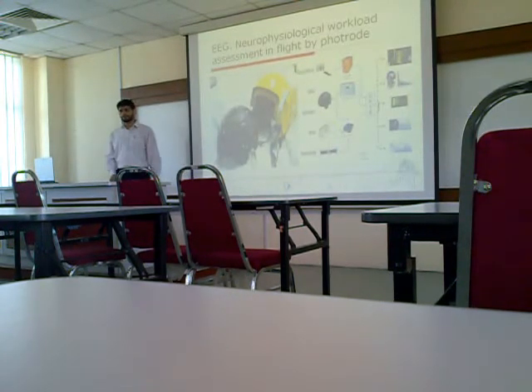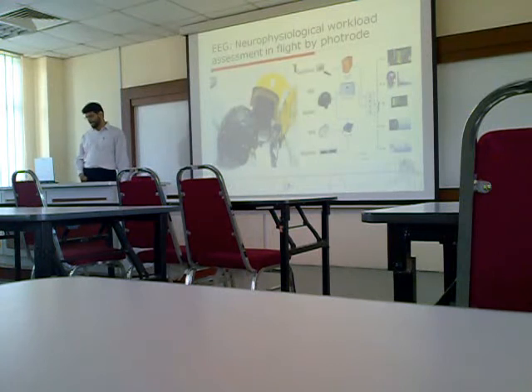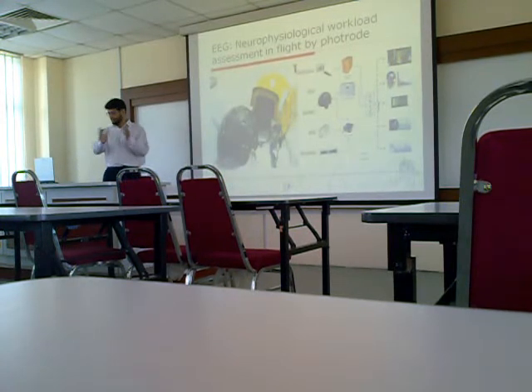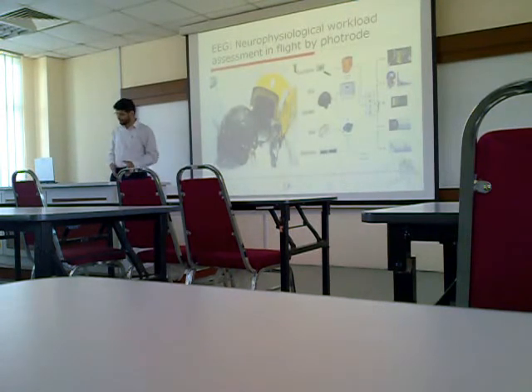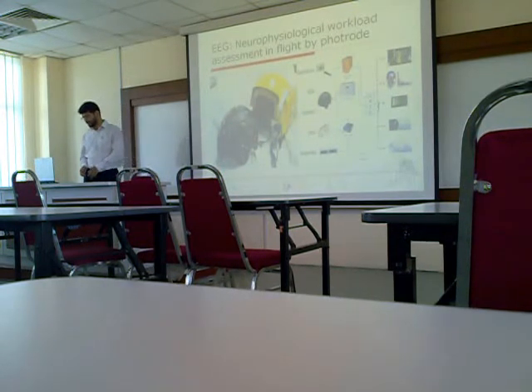DARPA, the Research Institute for the Military of the US, used a helmet and put inside the helmet some electrodes, which you see here, the red lighted electrodes, which are laser emitting diodes. He just puts it on his head, without any conductive gels, without contacts, and they can measure the electrical signal, a complete EEG system without noise.